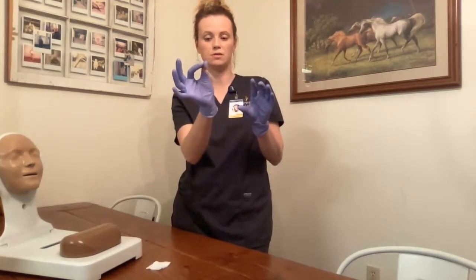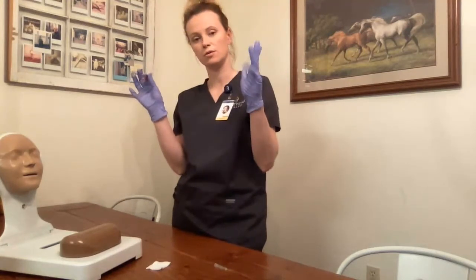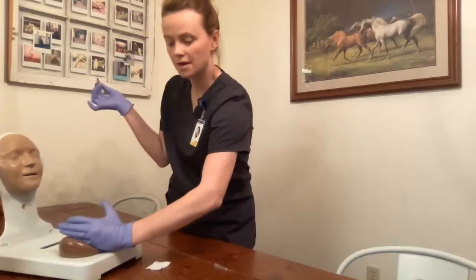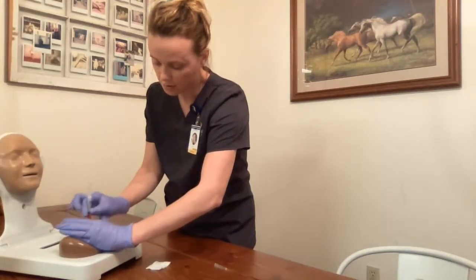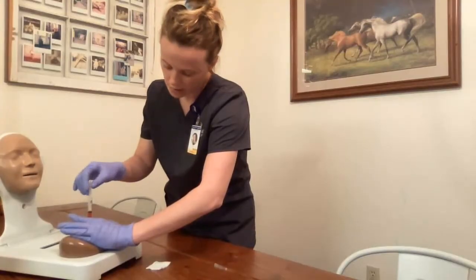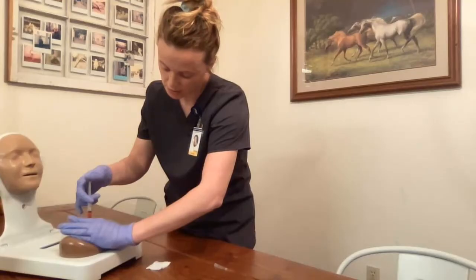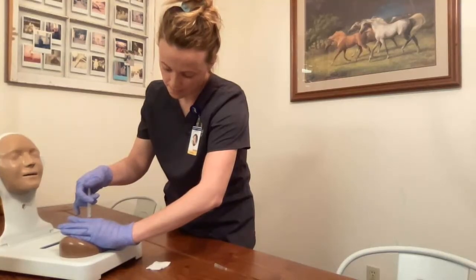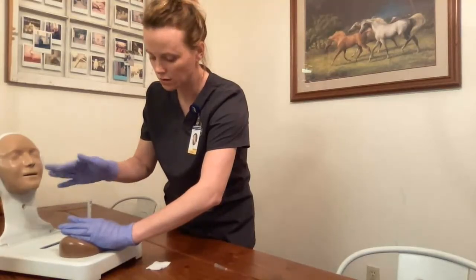When inserting the medication, I hold the syringe between two fingers, remove the cap, and hold it like a dart to inject at a 90-degree angle, palm down. I use the ulnar side of my non-dominant hand to apply tension and spread the skin without touching the injection site. I insert at 90 degrees, then use two fingers of my non-dominant hand to stabilize the syringe. I pull back on the plunger for 5 to 10 seconds to check for blood — there is no blood, confirming I am in the muscle. I inject the medication at 10 seconds per milliliter. I then hold the needle in place for 10 seconds — 1, 2, 3, 4, 5, 6, 7, 8, 9, 10.